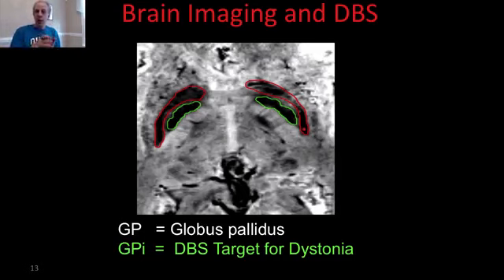And the beauty of that is that when we talk about active contours, normally we talk about gradients of one image. Now you can take gradients of multiple images because you have multiple modalities together. So we talk about T1, T2, the susceptibility-weighted image. You can actually compute gradients with all of them together. Remember, we talked about vectorial gradients. So now at every voxel, I don't have one scalar number.